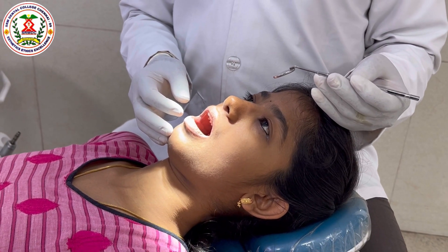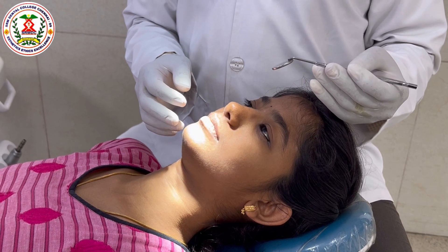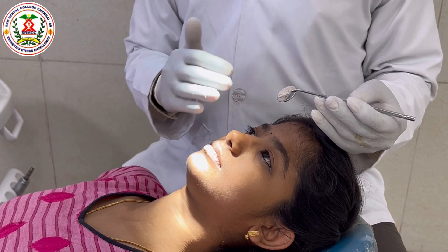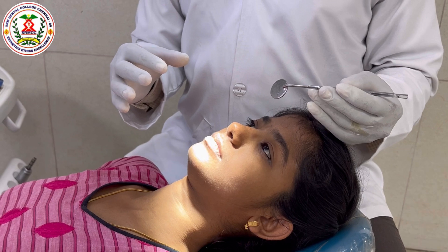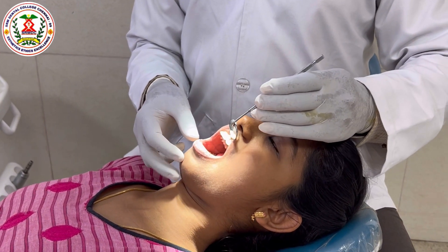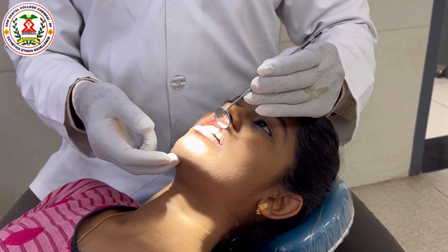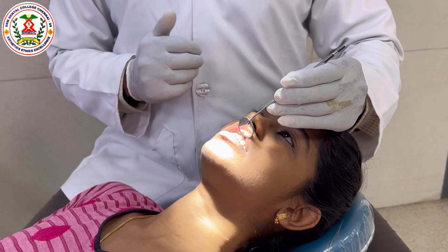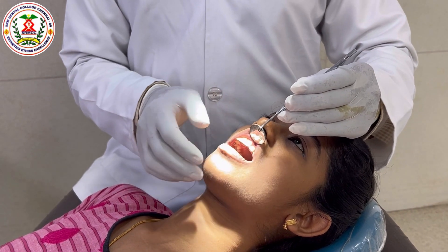We saw the V1 position, which is the position of the patient's head. Now we will see V2 and V3 positions. These positions are based on the quadrant you want to work on and are universal — they apply for restorative, extraction, or periodontal procedures. The V2 position addresses the maxilla and mandible: for the maxilla, ask the patient to look up so that the maxillary occlusal plane becomes perpendicular to the floor.